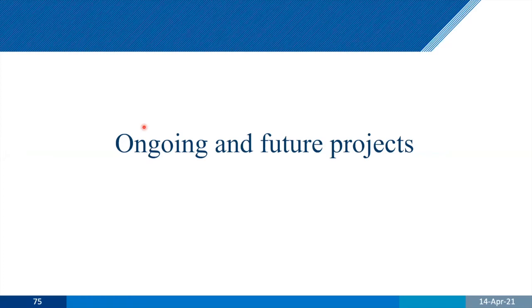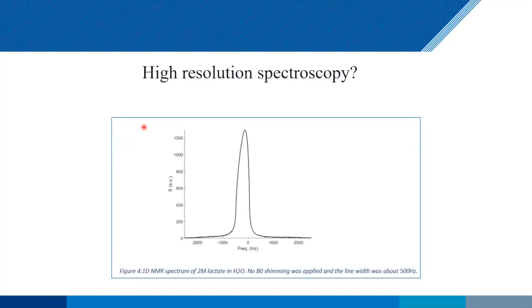So what are we doing? What do we see? What is kind of interesting to look at in the future? I'll start off with one thing that's completely non-obvious, and that's to do high resolution spectroscopy. High resolution means like 1 hertz spectral width. Here's the spectrum, which is 500 hertz, maybe a kilohertz. So how are you going to get any kind of information out of that?